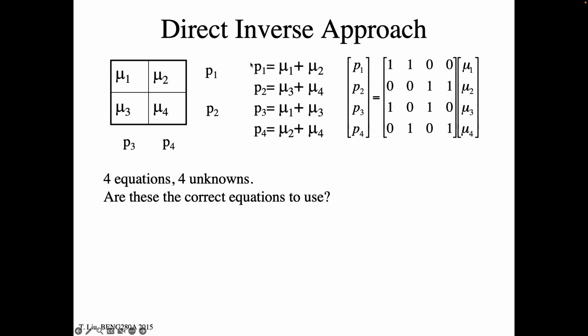So if I take a value on my detector here, the projection there is the sum of mu3 and mu4. Now let's rotate the system and take a projection this way. This is the sum of mu1 and mu3, and this way is the sum of mu2 and mu4. So I have 4 measurements that I've taken with my detector at 2 angles.